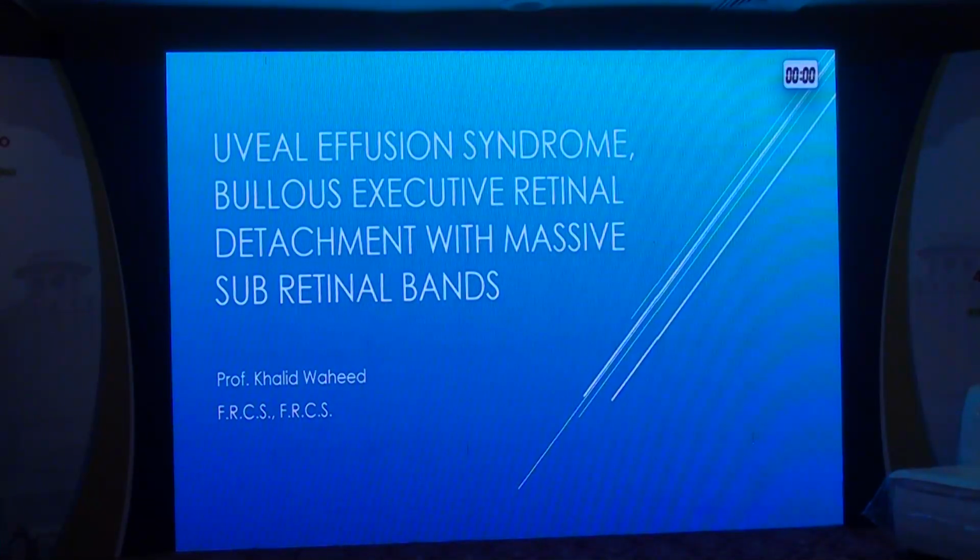So the idea of showing you this patient is to know how to deal with patients with subretinal fibrosis, how to remove subretinal bands. Now, normally we encounter 1, maximum 2 bands, and sometimes we like to leave them if they are inert and not encroaching on the macula, and sometimes we have to remove them. But having 5 trampoline rings on the retina really warranted surgical intervention.